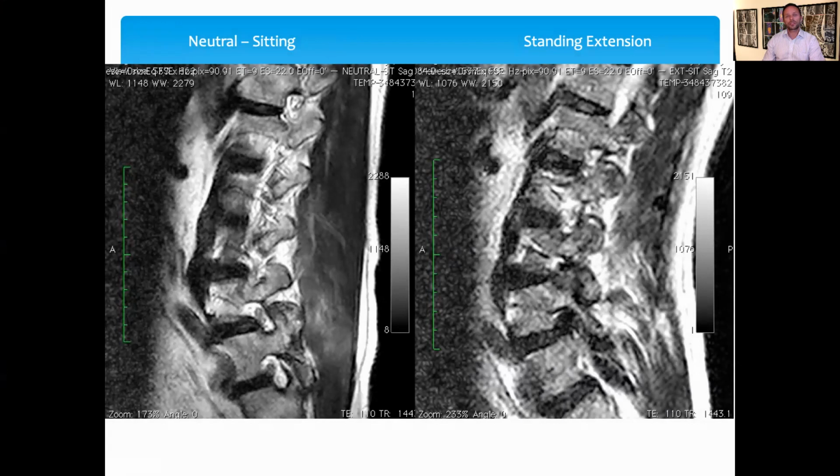And he actually lived in Switzerland, and he flew to London. He was here visiting friends, and whilst he was here, he popped into the clinic. And this chap had pain in the leg, predominantly when he was standing, walking, and in particular, extending. Now, he told me that he'd had sciatic pain investigated, and he'd had lumbar spine, thoracic spine, cervical spine. And when all that came back normal, he then went on to have a pelvic scan to see if there was any mass or any kind of nerve root compression there. But everything came back unremarkable.